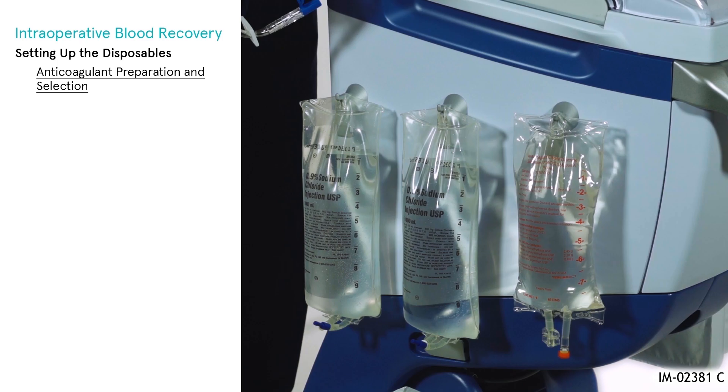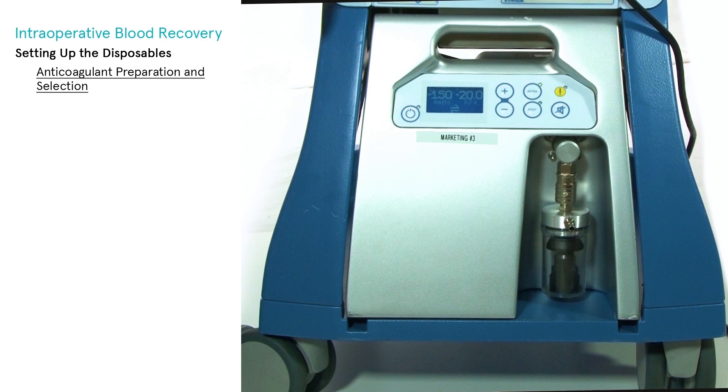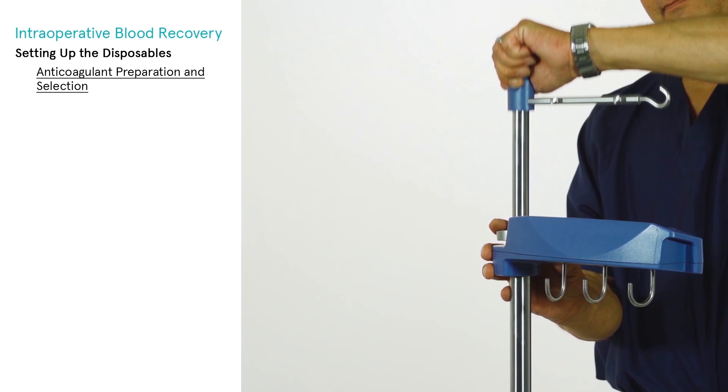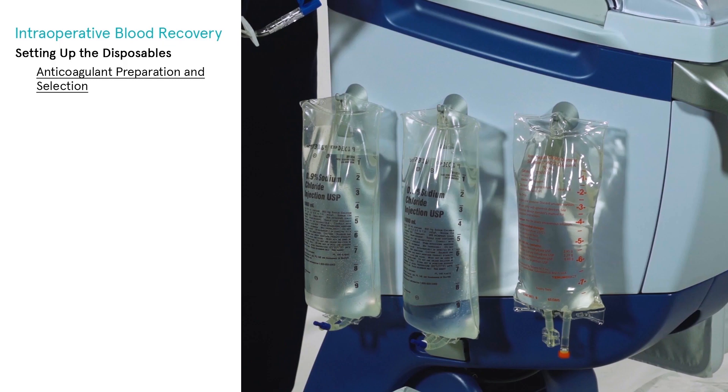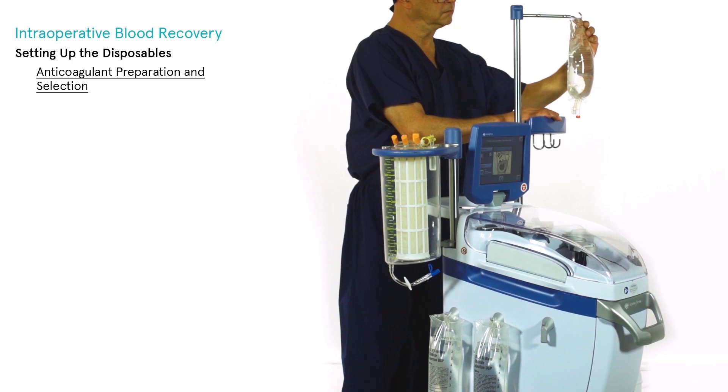Power on the Extra using the power switch on the back of the unit. The X-VAC may be powered on now using the display on the module, or you may wait until the Extra display screen is fully booted. Raise the IV pole and display completely. Prepare a bag of anticoagulant solution by mixing 30,000 international units of heparin per liter of sterile injectable normal saline. Alternatively, a premixed sodium citrate solution such as ACD-A may be used. Hang your choice of anticoagulant solution from the top IV pole hook.